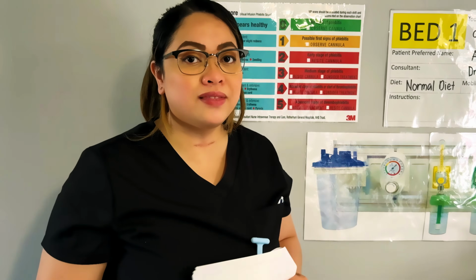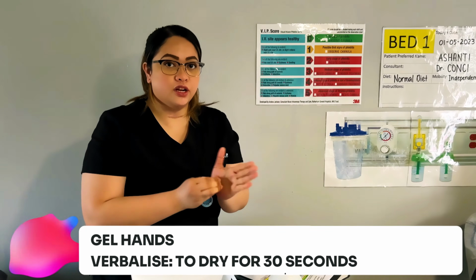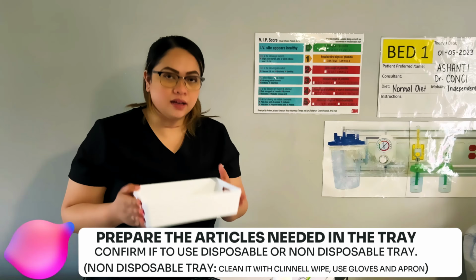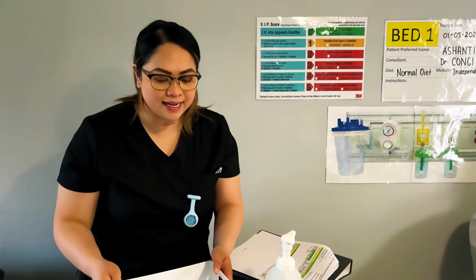I'm going to prepare now the equipment needed. I'm going to prepare all the articles that I need, okay? So, Miss Examiner, is this tray disposable or non-disposable? That one is disposable. This is a disposable tray as confirmed by the examiner. So, I'm going to prepare now all the things that I need.